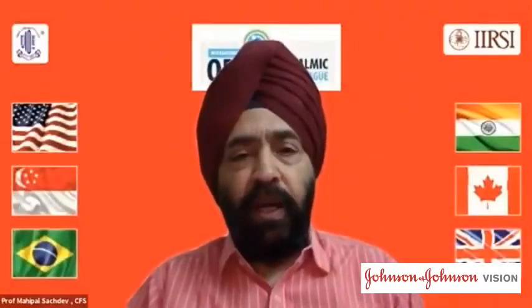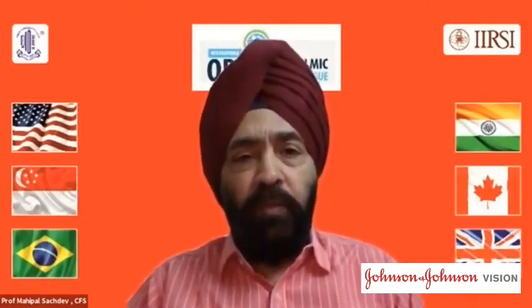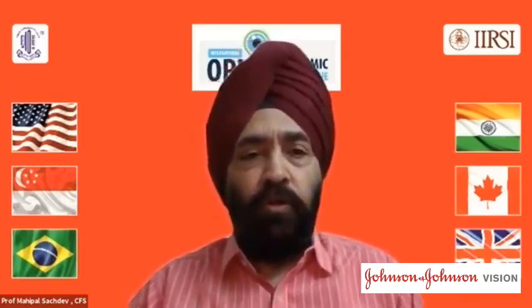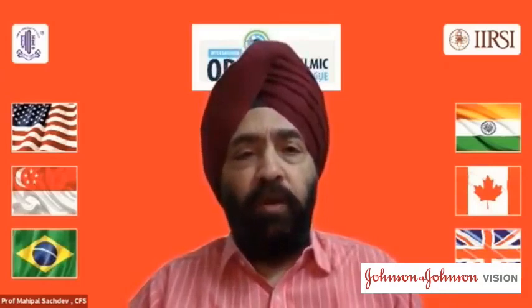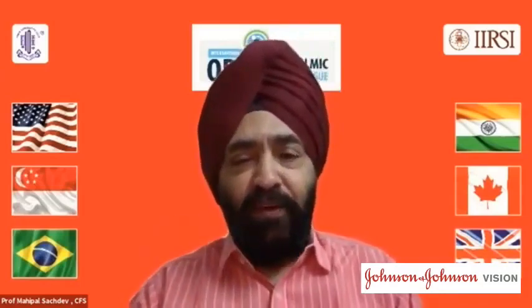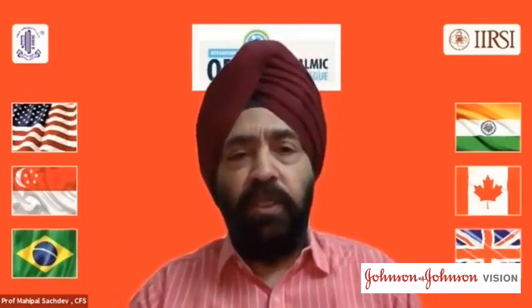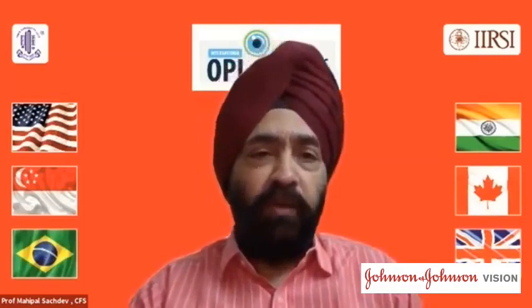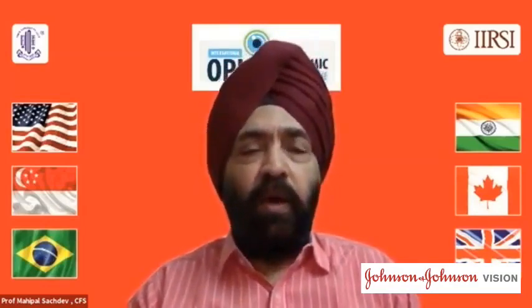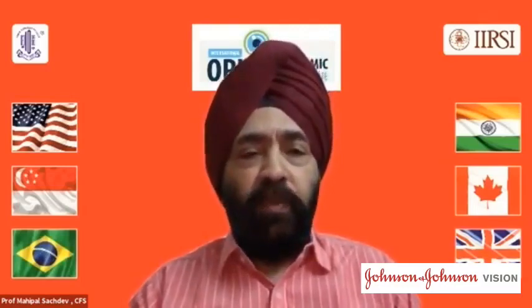If you have a very hard cataract, then obviously the chances of damaging both the corneal endothelium and the IOL, if you are too posterior or too anterior, can be there. So the normal precautions have to be taken, and obviously you don't want to burn the IOL with the phaco needle. If you do that, it's going to hurt it. But typically, in a desperate situation, it is one of the very good techniques. I have done it myself, and it often saves, as Lalit said, calling my VR friends to get me out of a nucleus that has fallen down or a part of the cortical fragments that have fallen down.